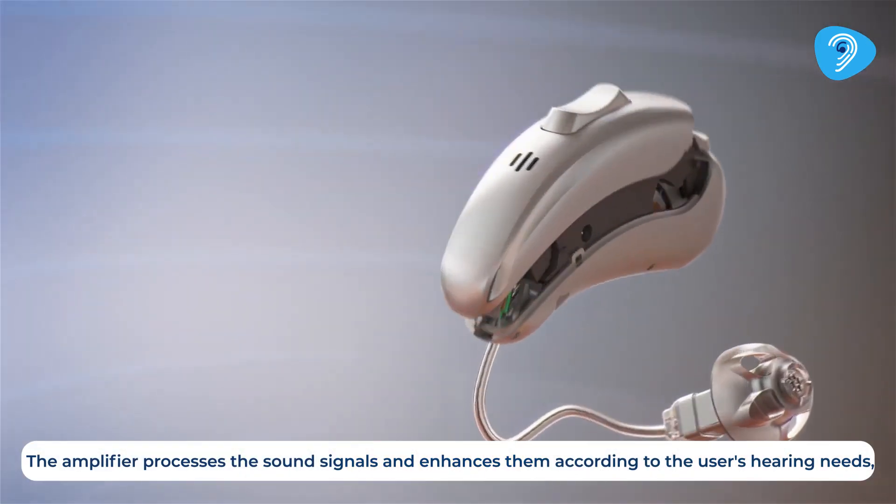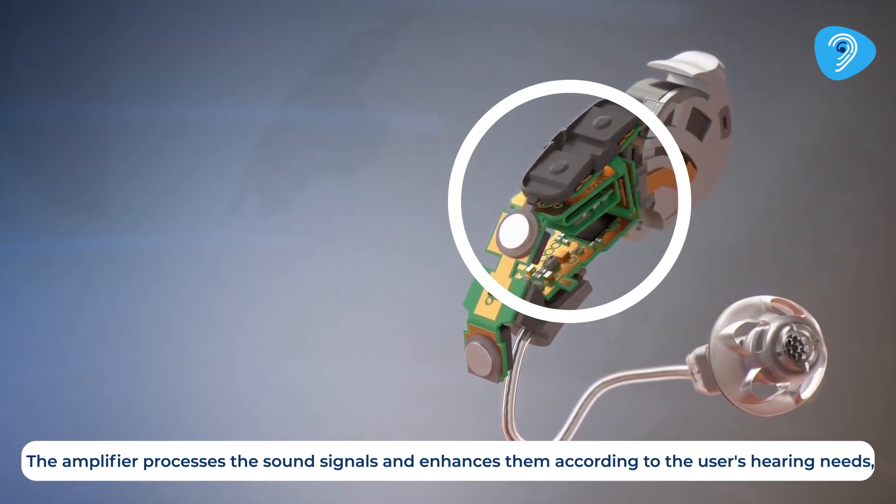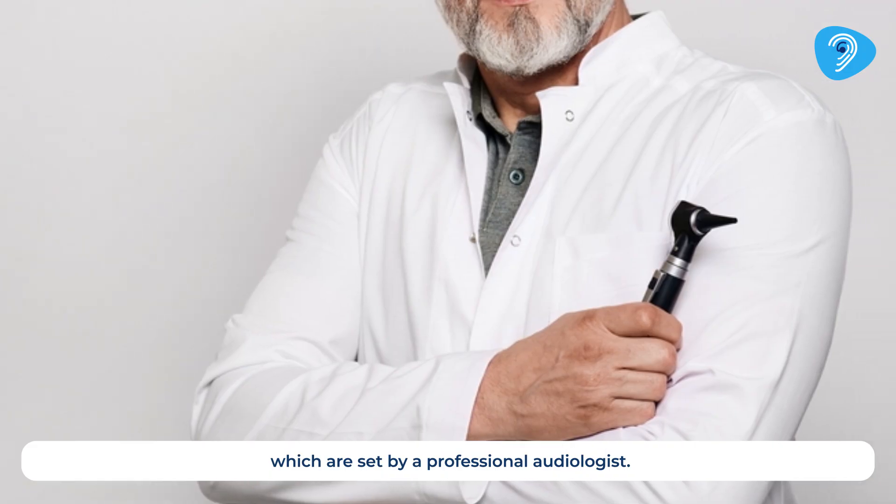The amplifier processes the sound signals and enhances them according to the user's hearing needs, which are set by a professional audiologist.